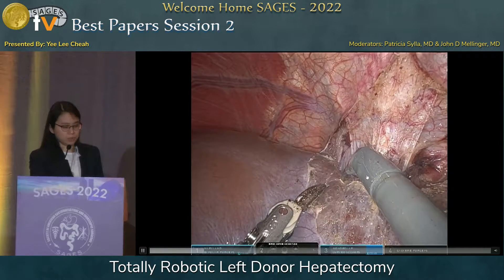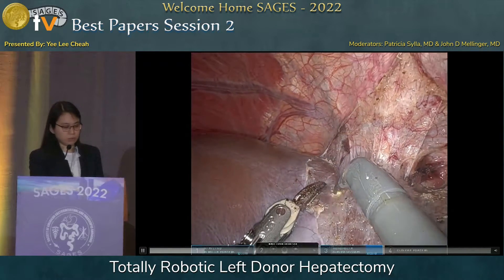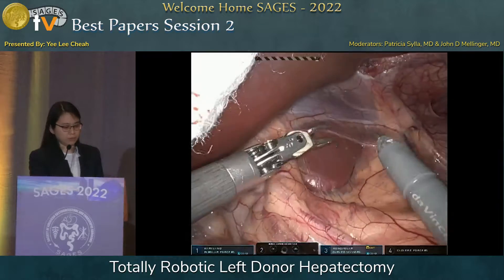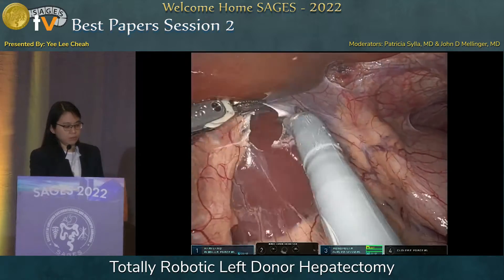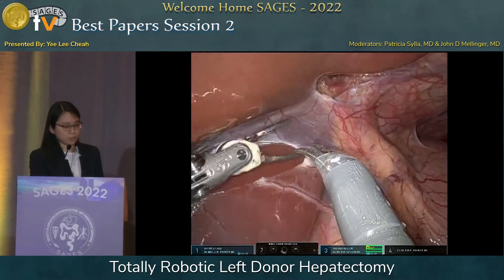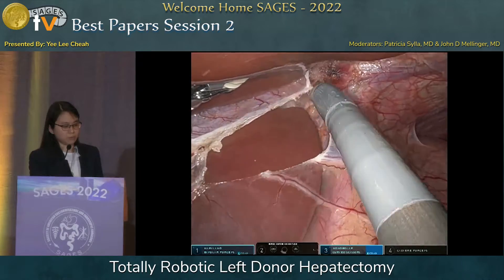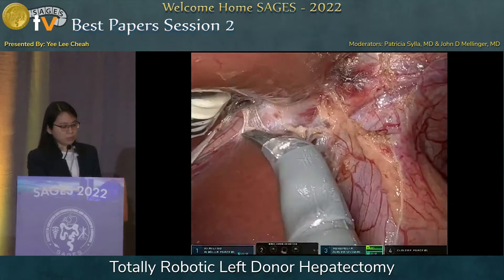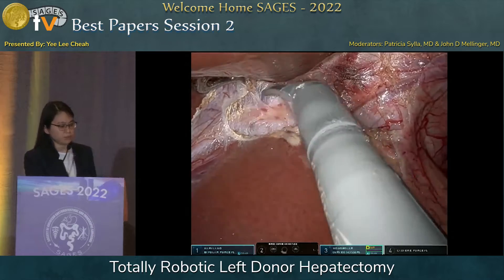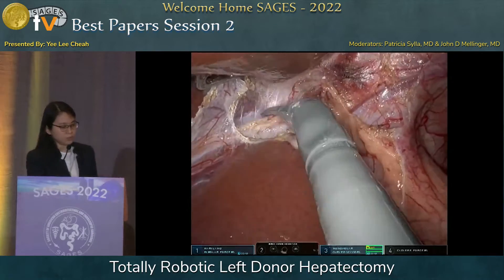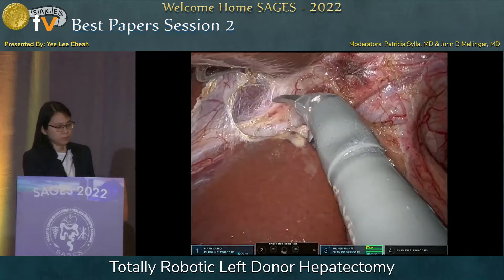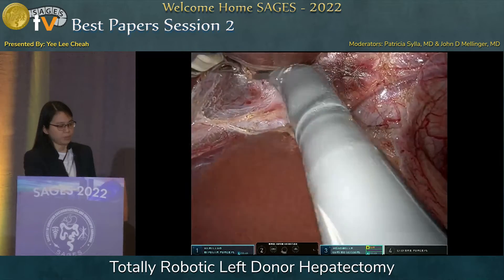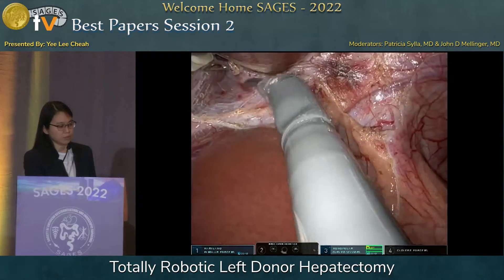We mark the superior end of our transection line between the right and the middle hepatic vein — this is where we will aim towards when we transect the liver. We then open the gastrohepatic ligament until it reaches our previously transected left triangular ligament. Dissection is performed at the superior end of the caudate groove, lowering the arantius ligament and mobilizing the corner between the left hepatic vein and the inferior vena cava.